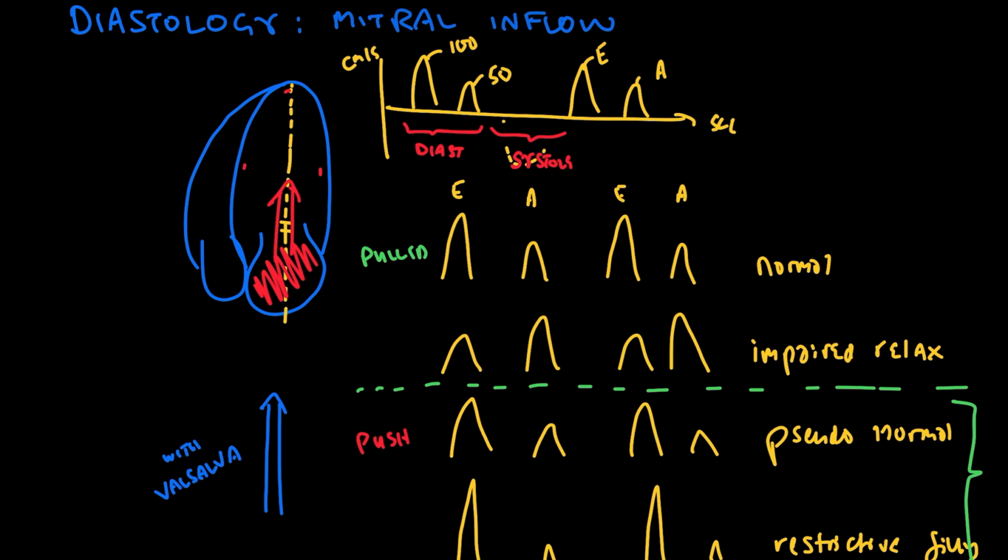In a previous video we talked about tissue Doppler, how we can look at the velocity of the left ventricle at the edges and see whether it is appropriately moving in diastole or not. And we said if there's any abnormalities in motion, there is some kind of diastolic or filling problem. We don't know what type necessarily, but there's something abnormal.